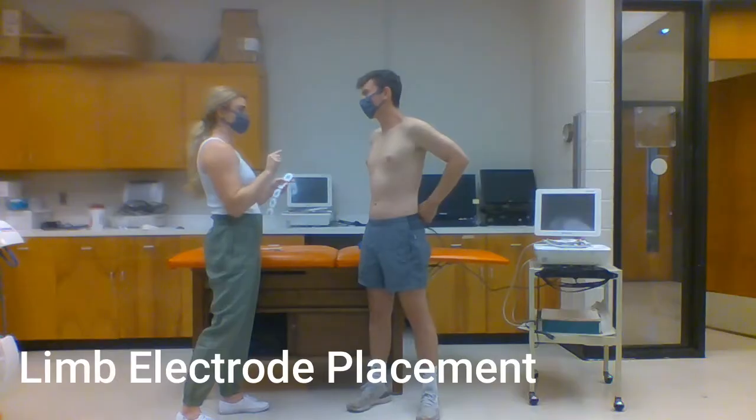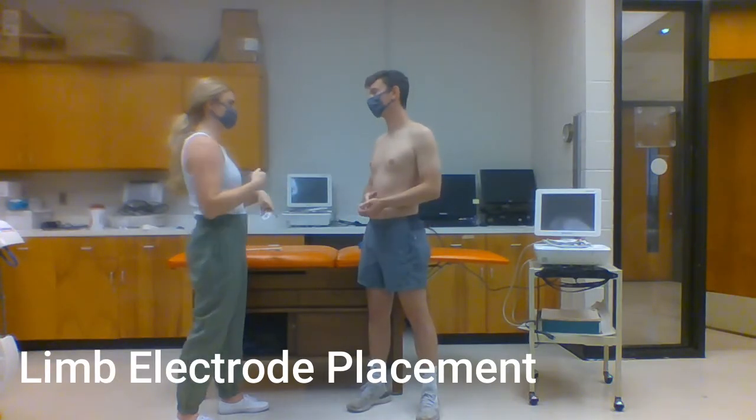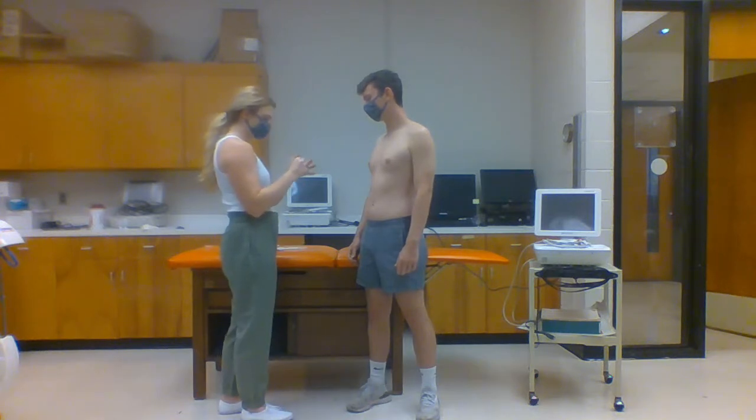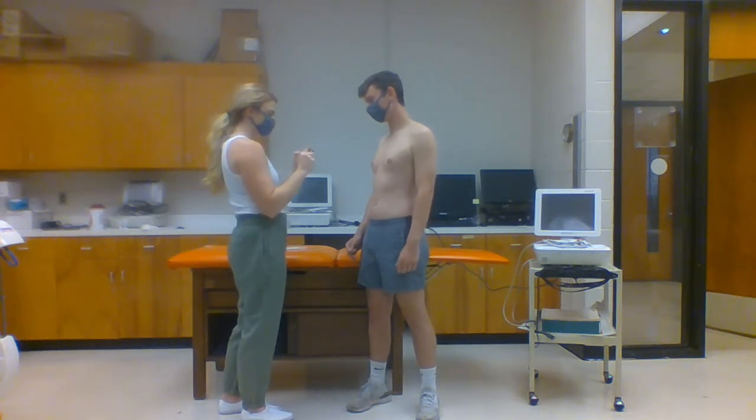This provides for better conduction during the ECG. For electrode placement, a normal or non-modified ECG test would have us place the 4 limb electrodes at the base of the ankle and each wrist. However, during exercise, we place the limb electrodes on the torso for a modified ECG. Therefore, for the purposes of this lab, we are performing a modified 12-lead ECG test. We will place the limb electrodes first.